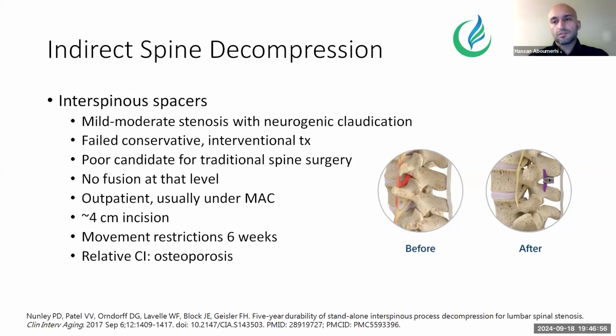These incisions are quite small to place these implants, 4 centimeters max. But you also want the patient to be able to withstand that sort of distraction of placing the implant. So generally speaking, patients with osteoporosis would be at higher risk of fracture. So I personally get a DEXA scan prior to make sure that the patient is a good candidate for this. But it's another tool that we have.